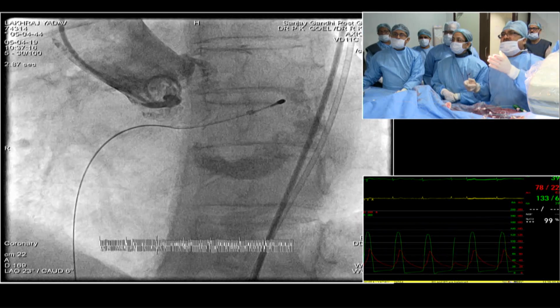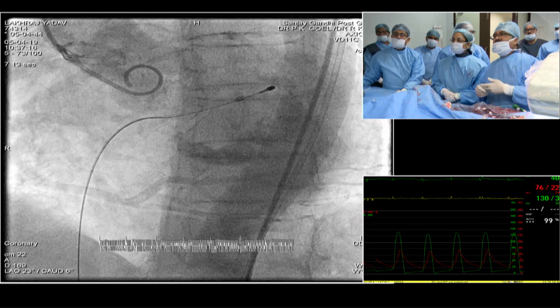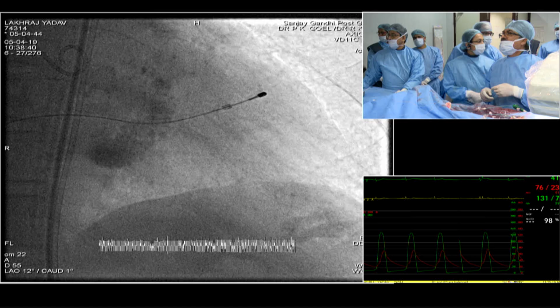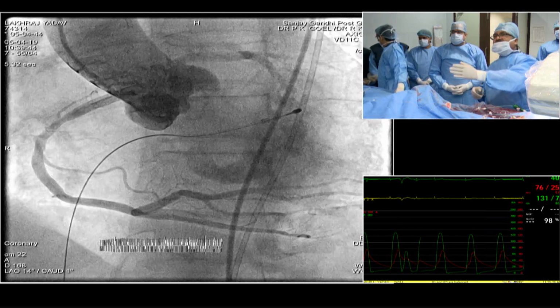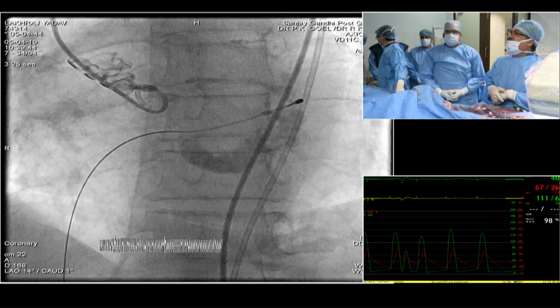So okay, that was the basal angio. This was actually in the right sinus. Can we see the next one? So that's the leak, the mild AR, and you have the annular plane there.